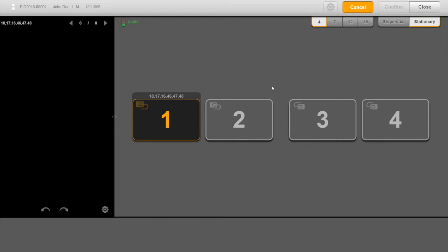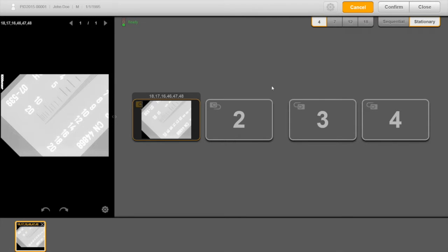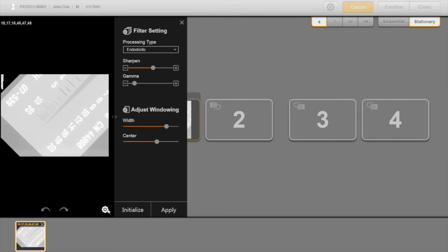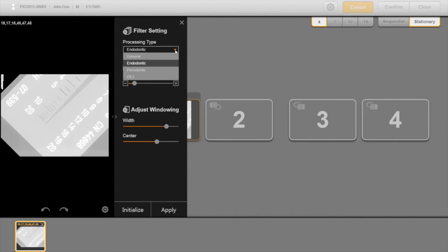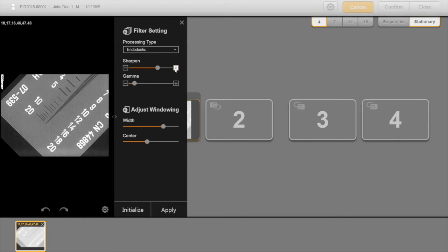Image Enhancement. RioView's image manipulation and enhancement tools enable users to improve image quality without having to reshoot x-rays or other images. This is your real-time filter. This tool offers a real-time adjustment that can be utilized for diagnostics without having to modify the original image. Depending on the user's specialty, the filter provides GP, endodontics, and periodontics options. Also, Sharpen and windowing controls allow users to customize the result images for the optimal image settings.